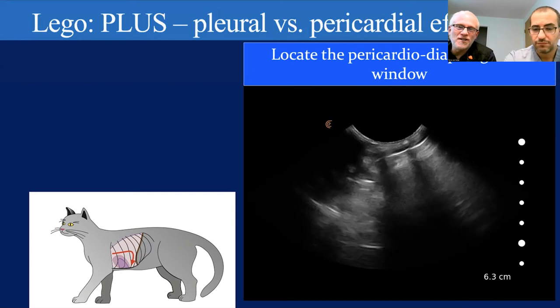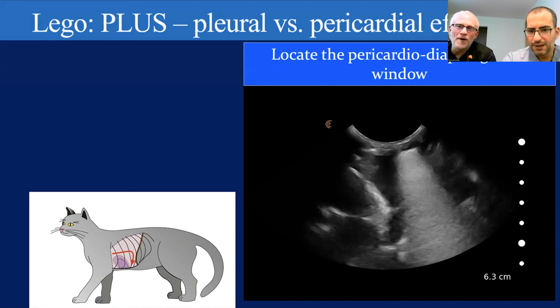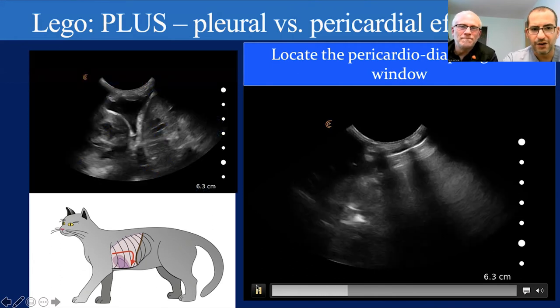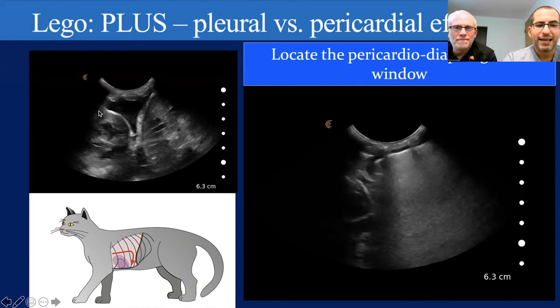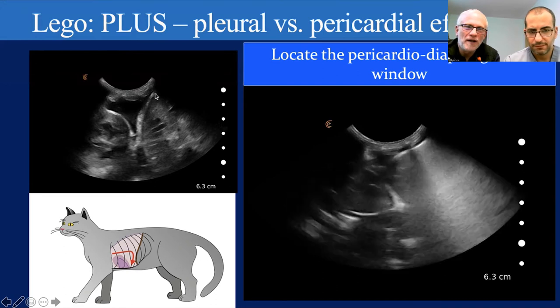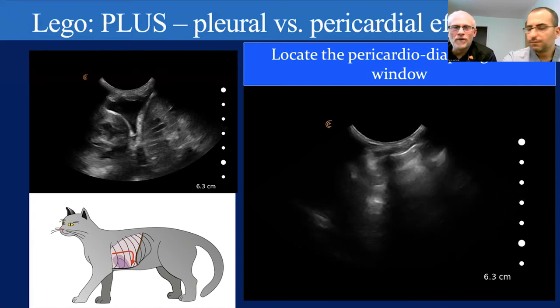We're on the lung. We're just going to span down and try and put the heart there. We start to see the heart. Let's see if we can get that diaphragm there too. Boom. What are you dealing with, Dr. Chalhoub? Pleural, pericardial. Definitely some pleural effusion, Dr. Boysen. I'm going to pause it in just a sec. Oh, there it is. There's the still image. And we can see that fluid tracking up and down the diaphragm. There's not a sac around the heart there, Dr. Nope. And again, if I look to my favorite spot, the costophrenic recess, there it is, actually filling that costophrenic recess and pulling the diaphragm, allowing it to be seen curving away from the chest wall.